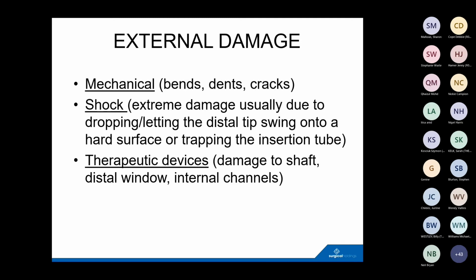So in terms of prevention, it's obviously being careful with the instruments, understanding that they are sensitive to shock. For example, trapping instruments in an endoscope cupboard door, or in a case or whatever, are classic examples of things that the various endoscope manufacturers' service departments will see.